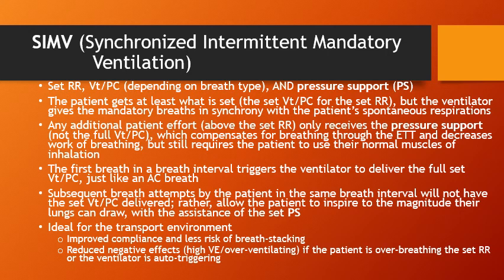Now, this mode is ideal, like I said, for the transport environment because it allows for improved compliance and less risk of breath stacking, and that's because it's synchronizing these breaths with the patient's spontaneous respirations. So the patient will be much more compliant with the ventilator and won't have that risk of breath stacking.